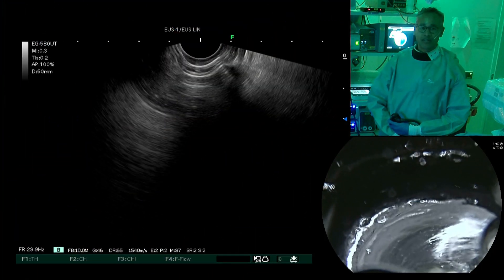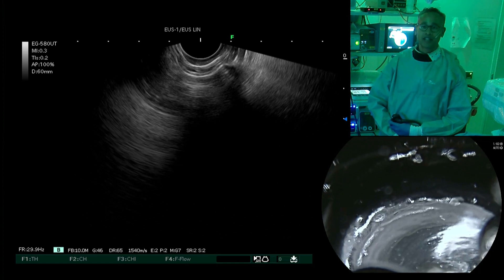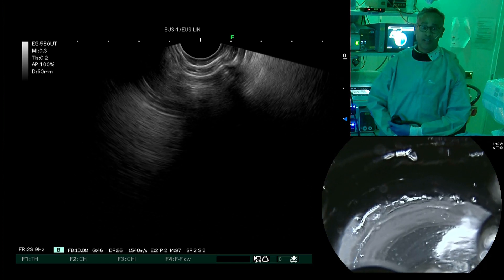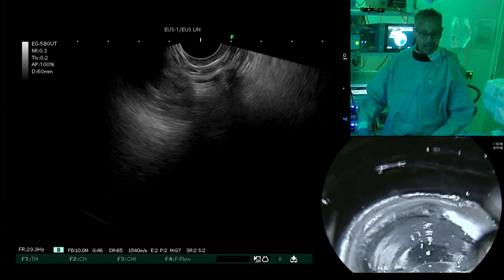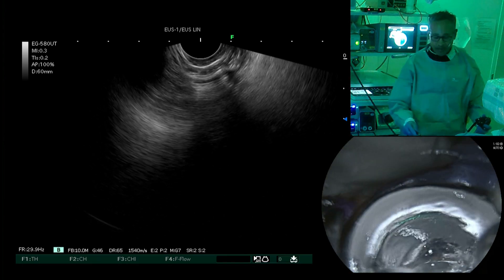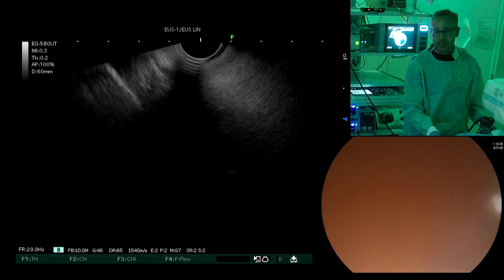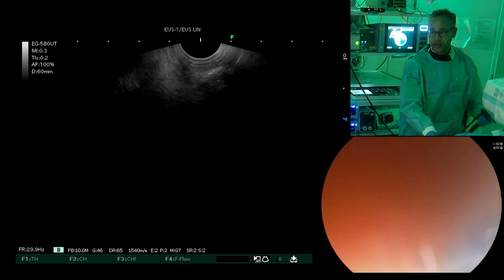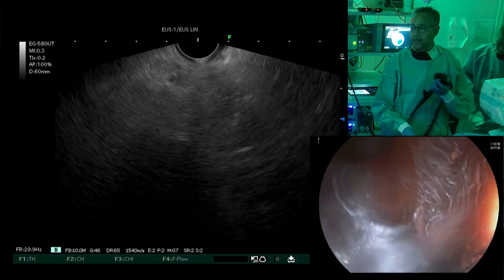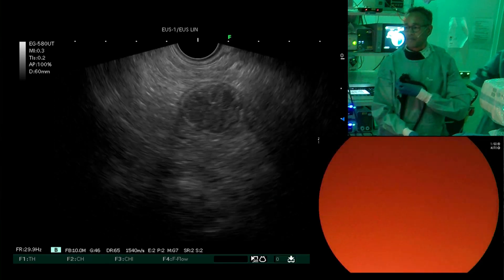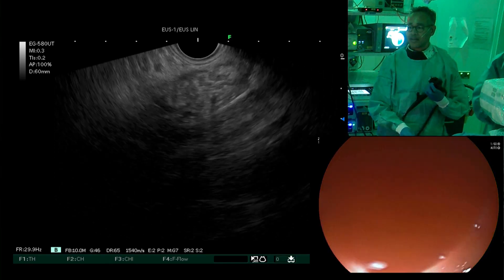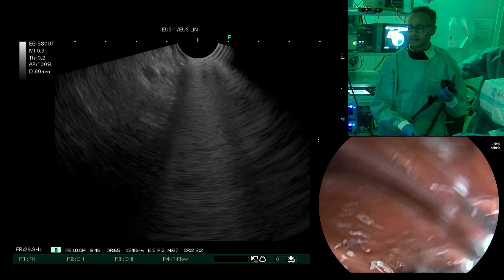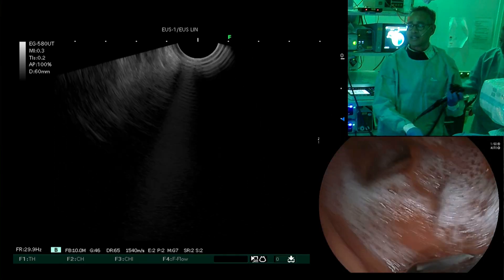Welcome back to our endoscopy suite. This is the ERCP and EUS room at the Leiden University Medical Center. We're going to introduce the endoscope — I'm using a Fuji linear EUS probe, which is quite flexible. We're going to pass the endoscope through the stomach towards the duodenum.